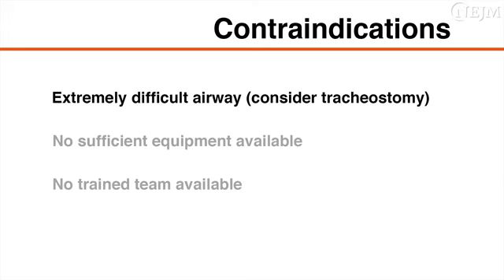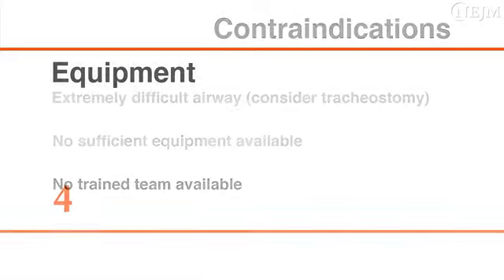Endotracheal tube exchange should be avoided in patients with an extremely difficult airway. In these patients, tracheostomy should be considered. In addition, the procedure should not be performed unless the necessary equipment and personnel who have experience in performing the procedure are available.